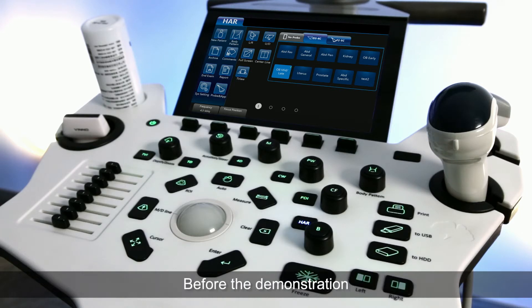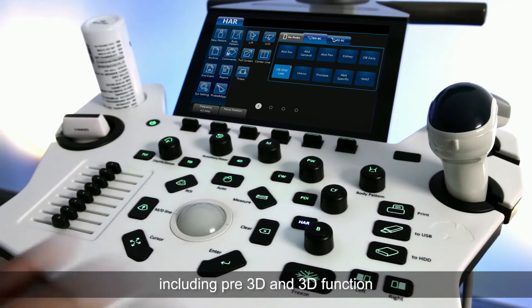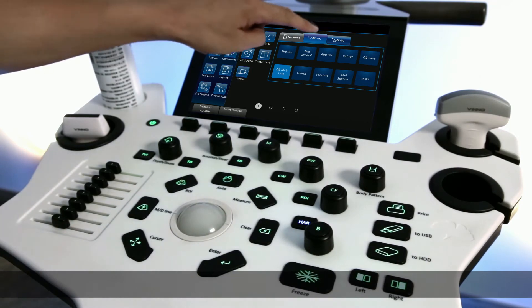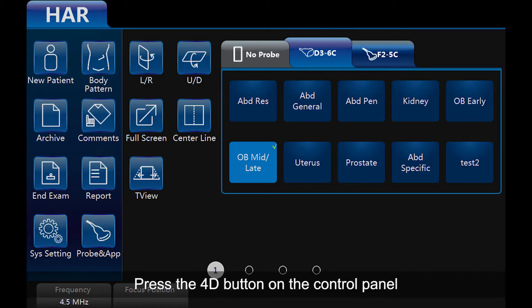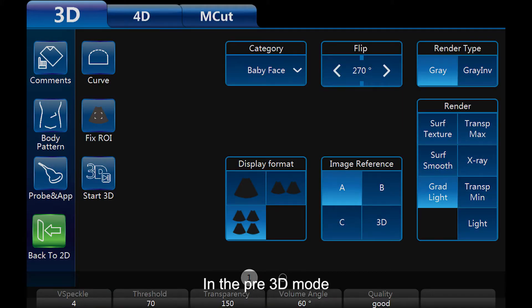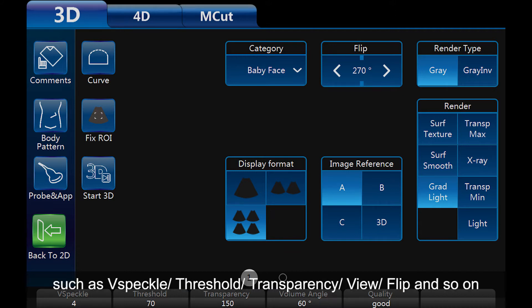Before the demonstration, I will explain to you all the parameters including Pre-3D and 3D function. Press the 4D button on the control panel and the system will enter into the Pre-3D mode. In the Pre-3D mode, we can find some parameters on the touch screen such as vSpeckel, Threshold, Transparency, View, Flip, and so on.